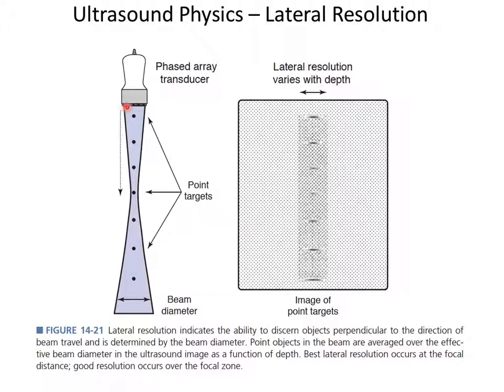We phase the signal such that there's a focal point right here, where the ultrasound comes together at a minimum distance, and then a reflecting sphere would give you a point spread function across the lateral direction that's proportional to basically the ability to focus that signal and then do the reverse processing when you hear the echo.